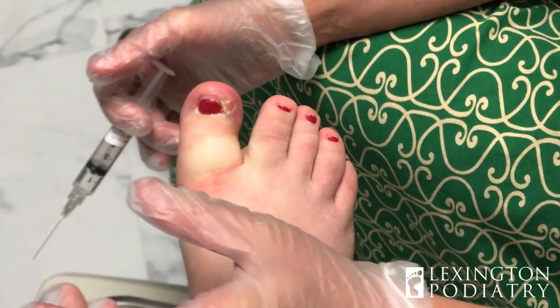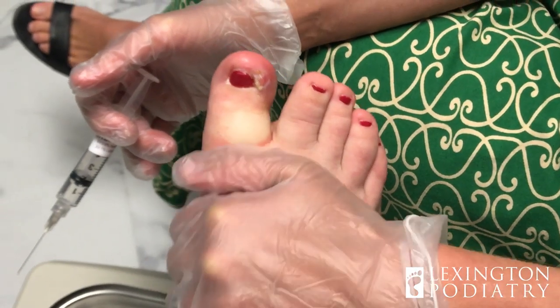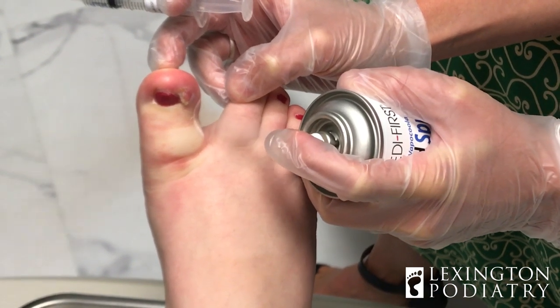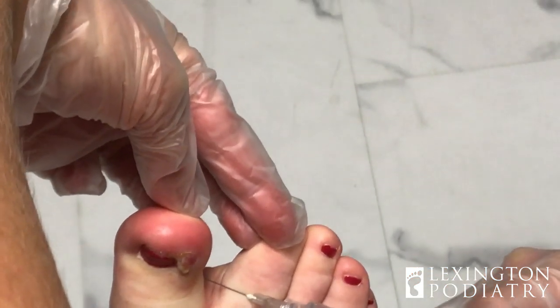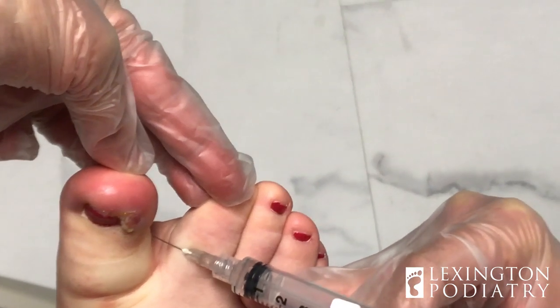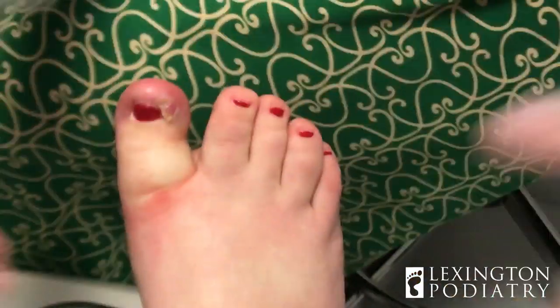So the bottom one here is a little more tender — just expect it, but I've already got some medicine in there to help numb it. Probably expect more of a big pinch down here. I'll hold your foot nice and tight to make sure you don't move, and if you need me to stop at any time just let me know. We are in no rush here. Extra cold spray — good job. Hard part's over. You did it. That was great. It's like a flu shot — no one's ever said that! So we're going to pause for a second, do setup, and we'll show you the rest in just a minute.